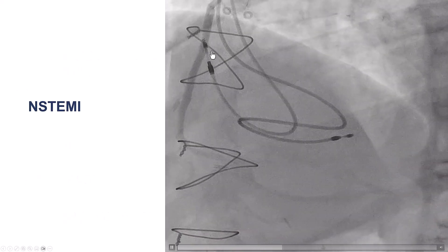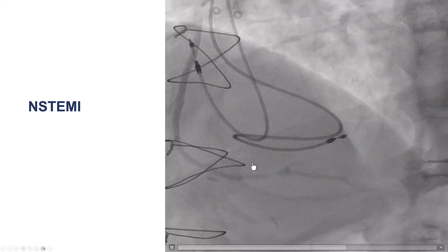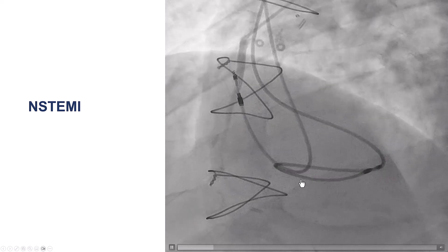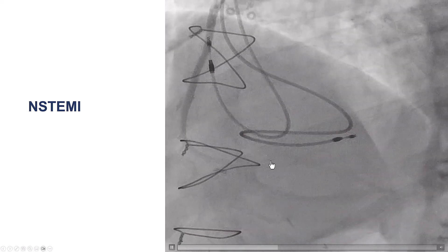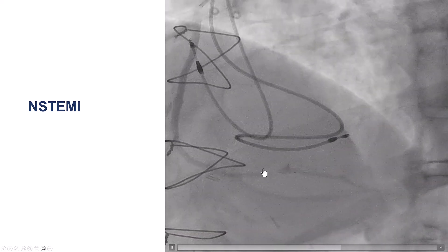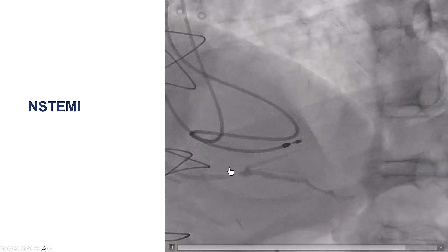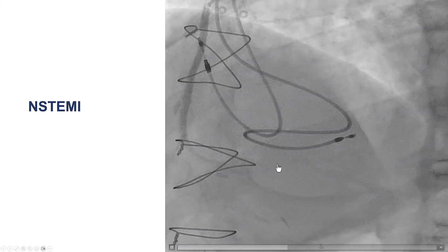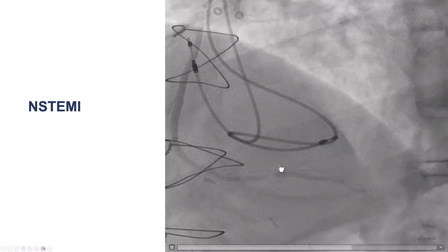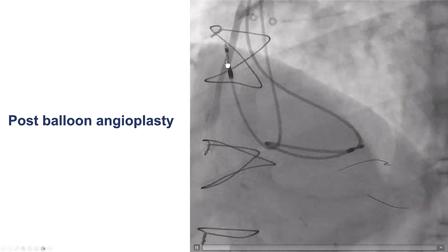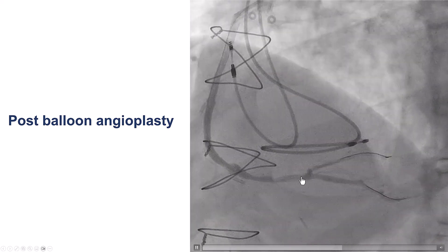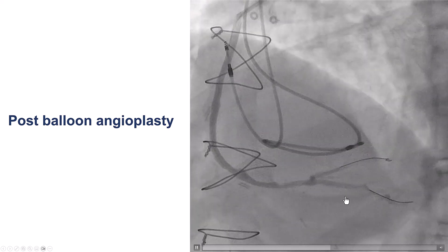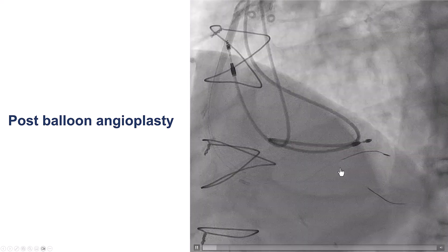This was the original angiogram when the patient presented with a severe lesion close to the distal anastomosis. It is very important that there was no stent placed, because if a stent is placed across the distal anastomosis of the saphenous vein graft, then going retrograde and recanalizing the native coronary artery becomes much harder. After balloon angioplasty, there is some residual disease, but there is TIMI flow into the PDA as well as the right posterior lateral.